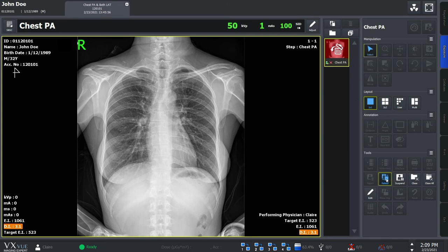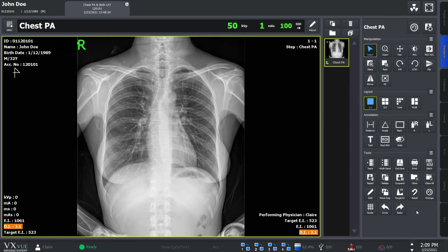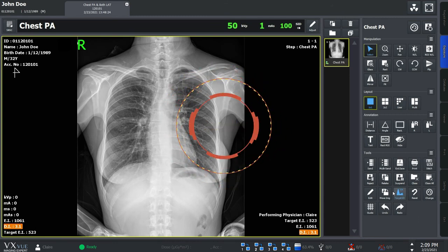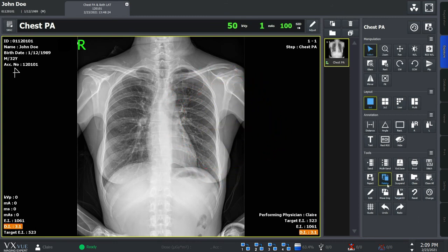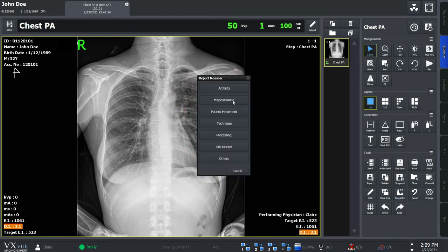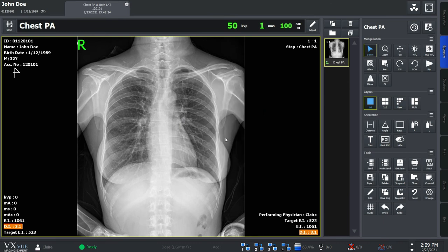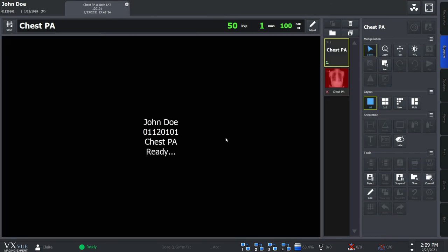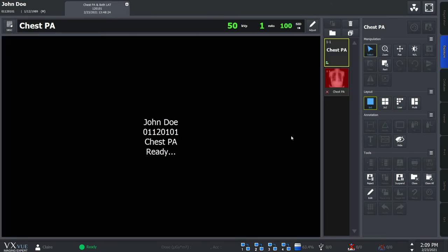Simply click on the icon here and you'll see that a new step is added with the same step information as the rejected image. You can also click the retake button right away without clicking on the reject button. It'll show you the original image has been rejected and a new step has been added with the same information.